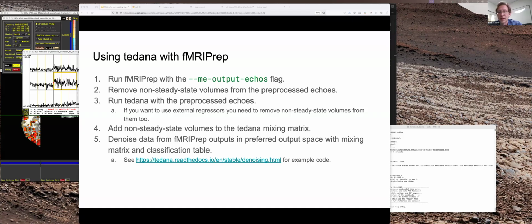I will note that with due respect to the analogy of rope and flexibility, there is a large amount of provenance that goes in the AFNI proc, so you can be sure of what you've run, because the AFNI version and the software versions are output. You get the processing script so you can see everything that you did. And I do think sometimes people do like being able to choose their analysis. I think even with fMRIPrep, you can choose different software and some different steps that you use.